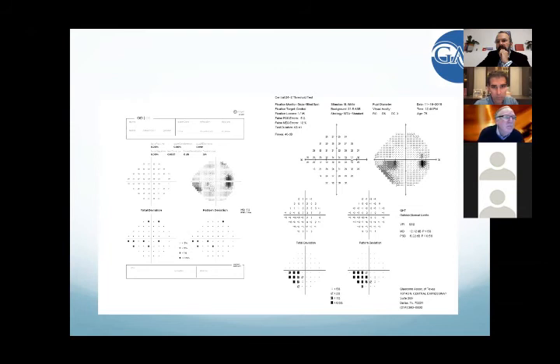And I may be wrong with this, Alberto can correct me, but it says on this, you can see the time, it's 5 minutes, 31 seconds. And I think that's for both eyes. Is that correct? That is actually each eye, which is in correlation with, it's a little bit shorter than the, Oh, okay, so that's per eye. Yeah. Okay, because let's see the fellow eye, Davinder.